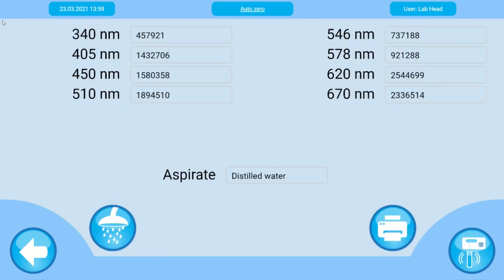The information displayed on the screen of the analyzer can be divided into 3 areas. Here we have the header with the date and time, the specific menu or page name, and which user is operating the device. The middle button additionally serves as a shortcut to the main menu. Then we have the main information with some local functions, such as a print button to print the displayed information. At the bottom, you have the return button and the continue or aspiration button.